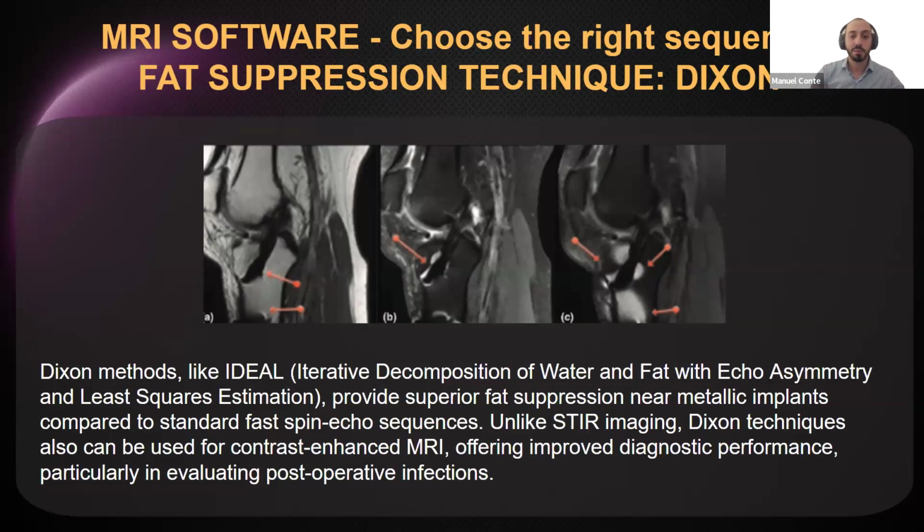I think in terms of sensitivity to the magnetic field it is in the middle, but actually it is a very good option because the SNR is quite good, and also we can use the Dixon post-contrast. So as you can see from the image, A and B are Dixon images, and C is a FATSAT. You can see that the first two images have much better image quality compared to C.